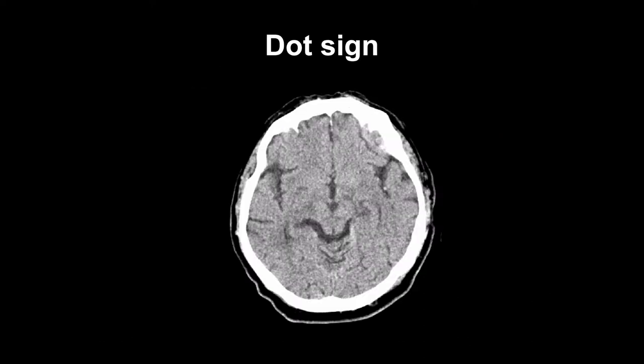This scan demonstrates the dot sign, a variation of the dense middle cerebral artery sign. It indicates a thrombus in the distal middle cerebral artery branches that lie within the sylvian fissure, as indicated by the blue arrow, where they turn perpendicular to the slice.